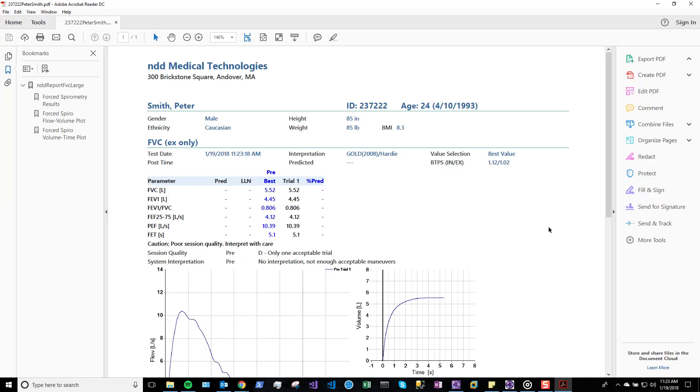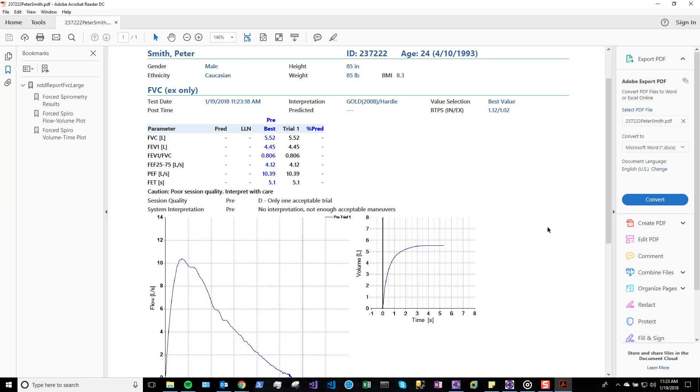Remember, discrete data is populated in an EMR along with standard reports. This is one integration option available using EasyOne Connect with EasyOne products.